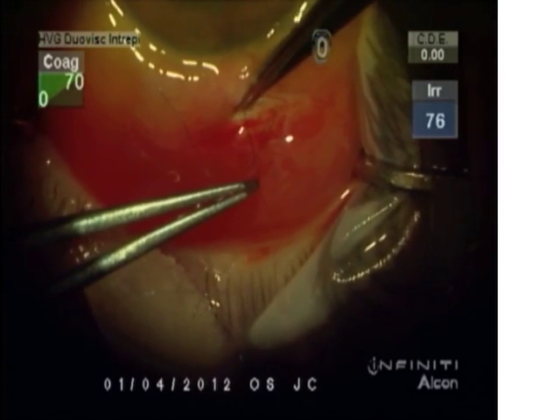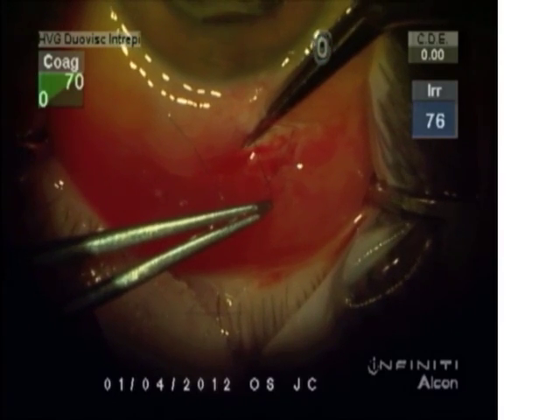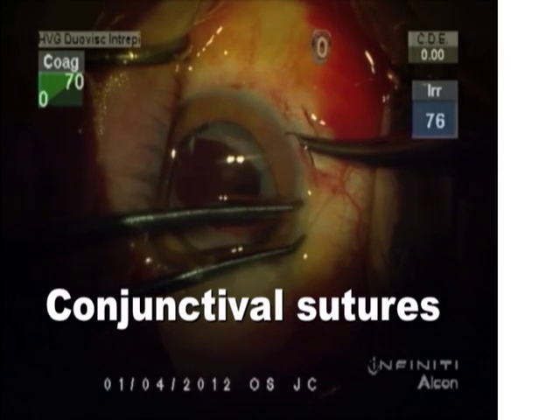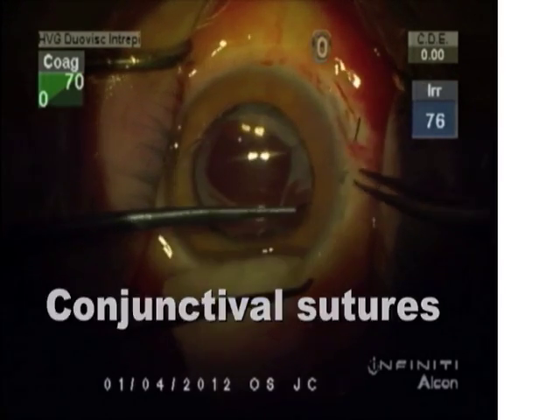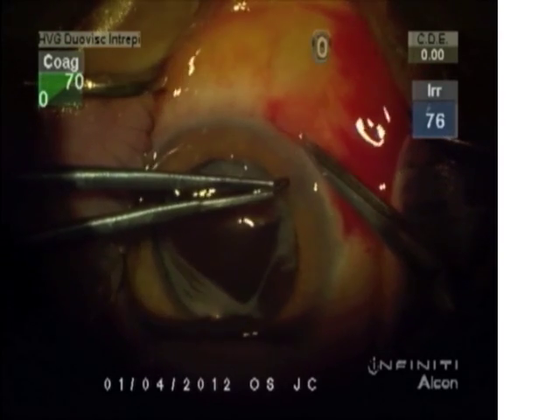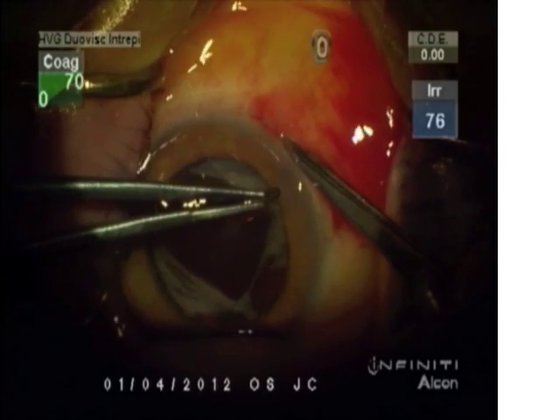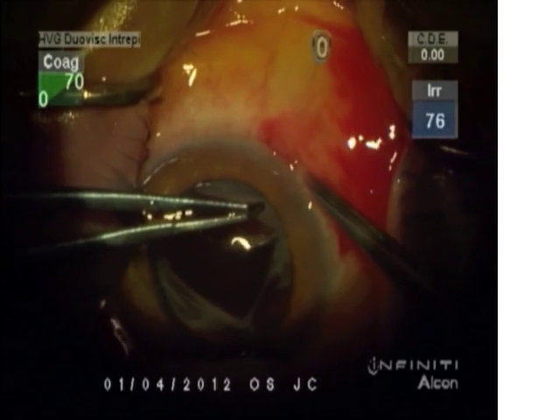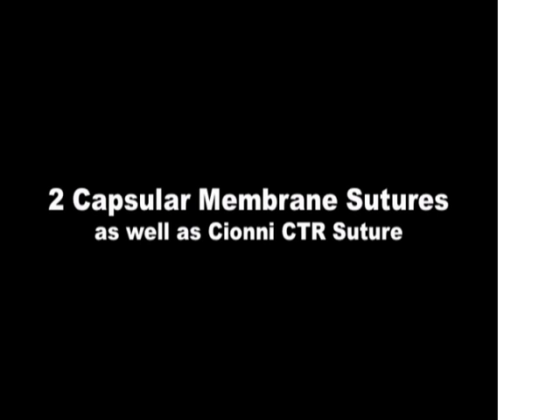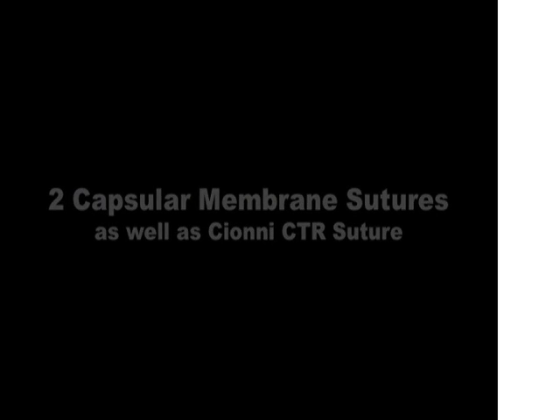All the knots are trimmed and tucked into the tunnels. The conjunctiva is closed with 10-0 Vicryl, starting inside the incision so the knots are buried. We have a tripod refixation for centered, stable fixation using two capsular membrane sutures as well as the Cionni CTR suture.